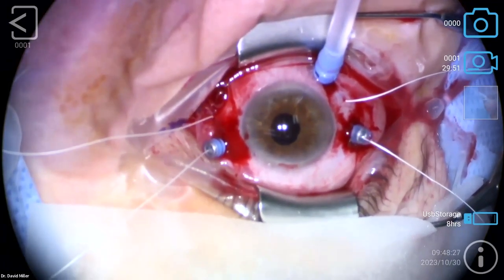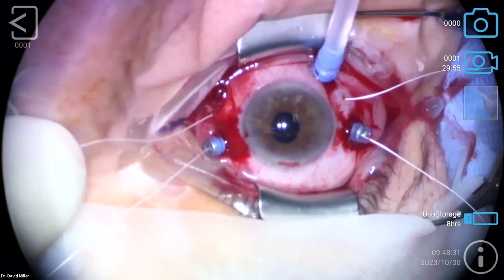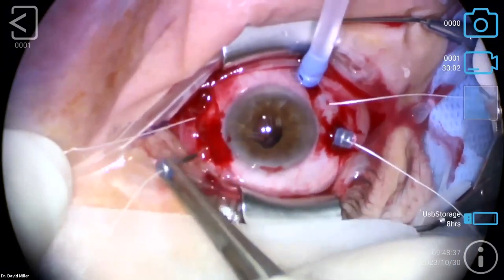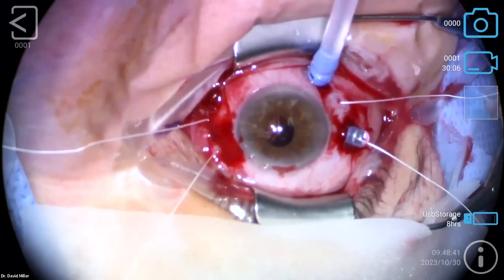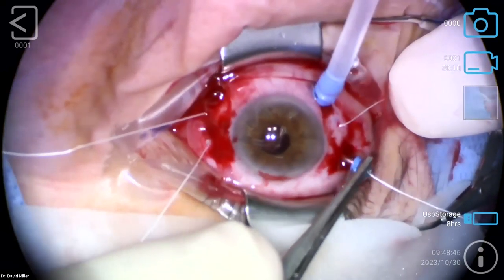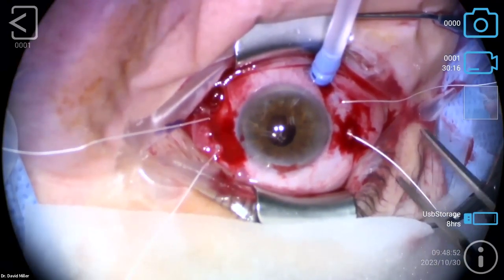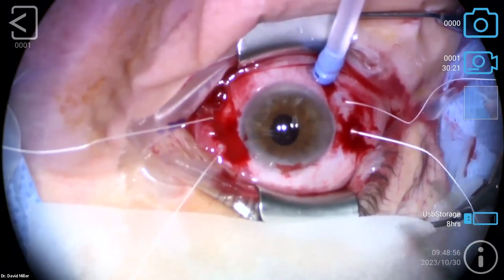Okay. Now we'll take the Bonaccolto forceps. We're going to pull the cannulas because we don't want those. I'm just going to keep my finger down right here and pull this out, and Harrison's going to put his finger there. Everything that's gone wrong or could go wrong has gone wrong, including one time we didn't have our finger down tight enough and pulled the suture right out of the eye. Mike's laughing because that was him.